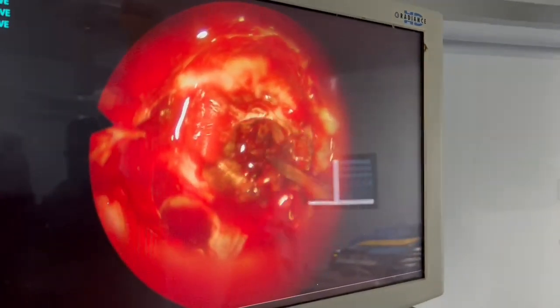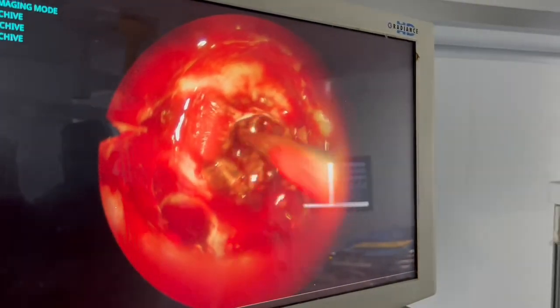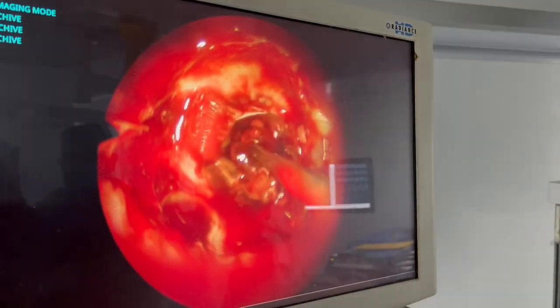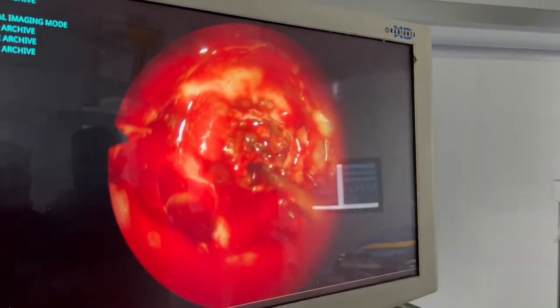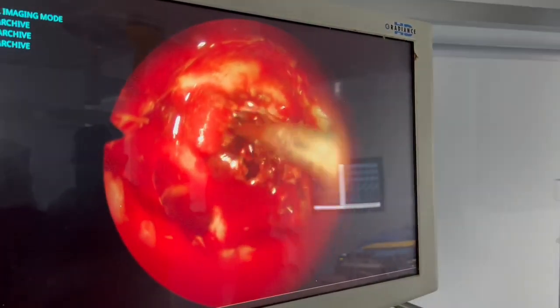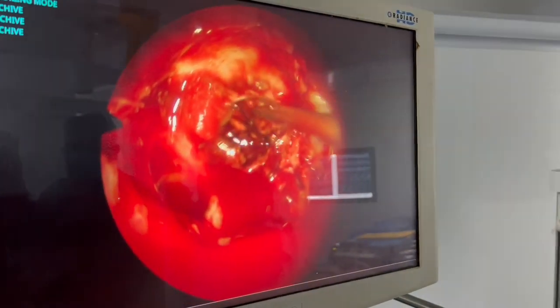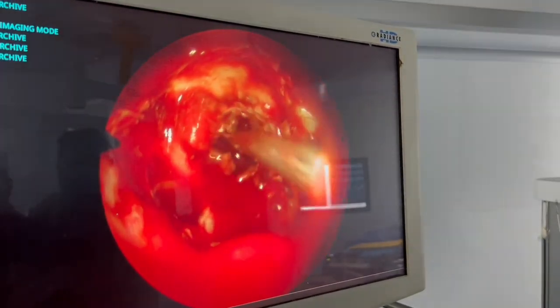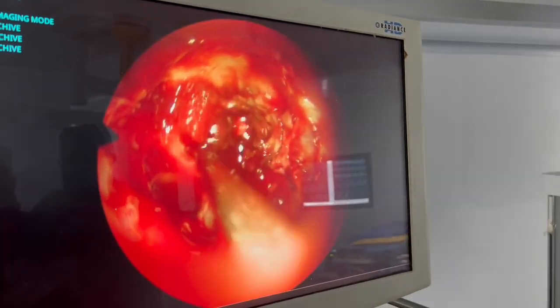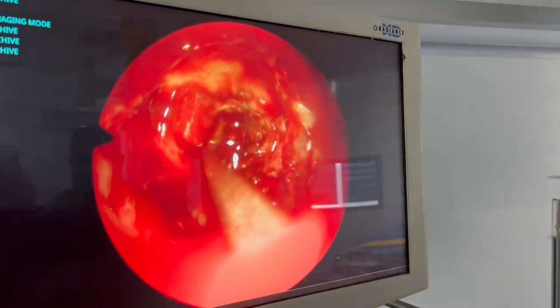In summary, central core tumor removal, then inferior and posterior tumor removal, then lateral tumor removal, and at last superior tumor removal should be done till the arachnoid falls. For lateral and superior extension, you can use an angled endoscope, 30 or 45 degrees, for visualization. Avoid direct cavernous sinus entry unless the tumor is soft or extends inside the cavernous sinus.